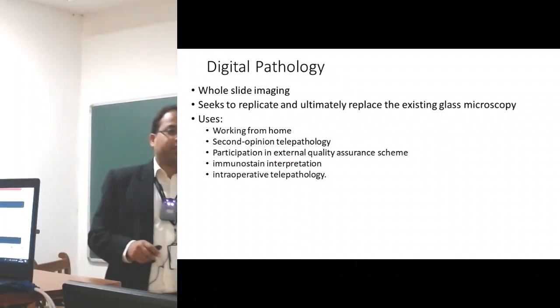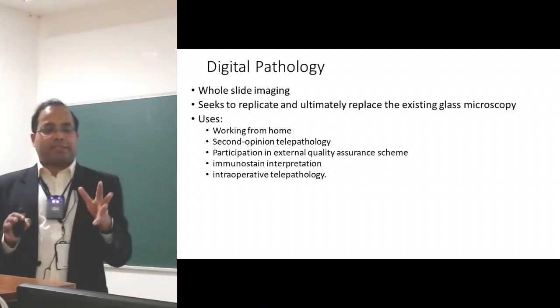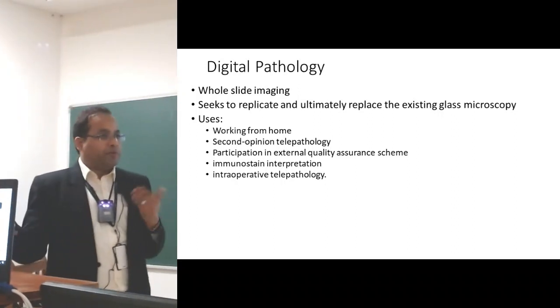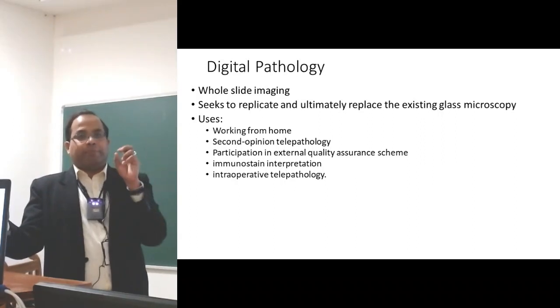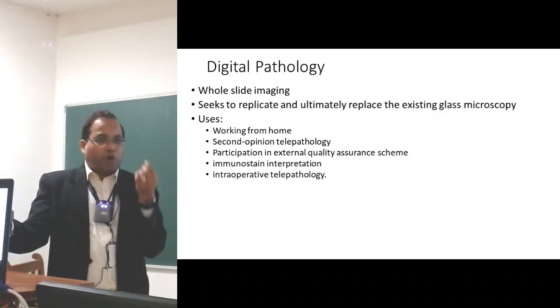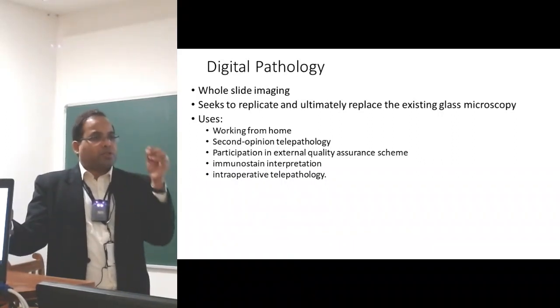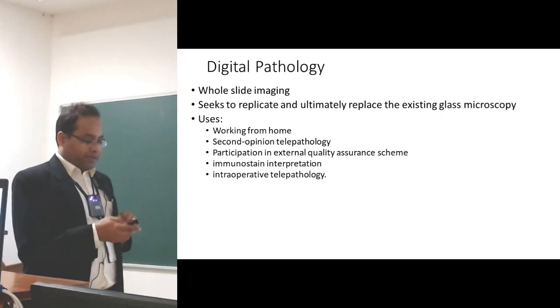Participation in external quality assurance schemes. We as pathologists are strictly governed by quality control measures, and one of them is our own quality, whether we are able to maintain our quality in reporting. So what happens is they send certain slides to us and we have to make the diagnosis and send them back. So a small biopsy is difficult to send to 300 centers throughout the country, so that they can take a scan. In 5 minutes they can take a scanned picture and can send it to different centers.